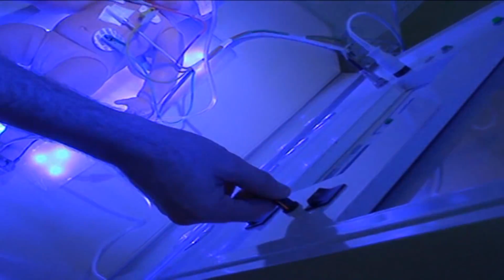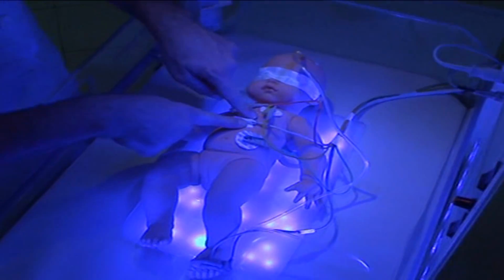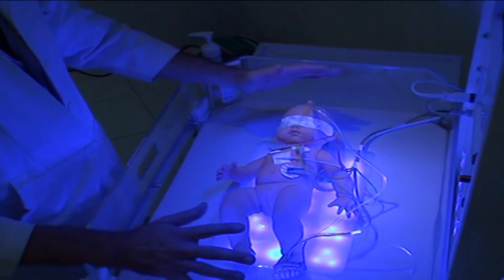Okay. For warmer training video, for example, we'll turn on our warmer. We can adjust the set temperature right up on the front panel. We'll connect the sensor, skin sensor on the body of the baby, and then that will help regulate just like any overhead radiant warmer.